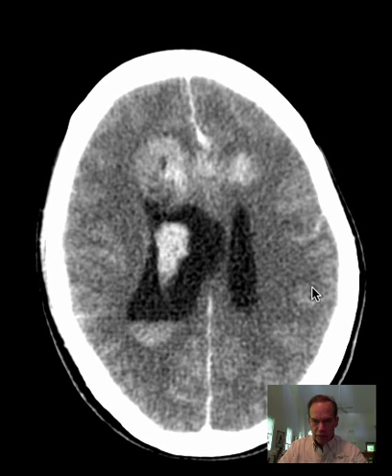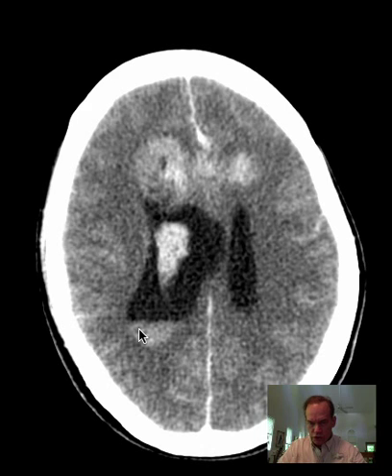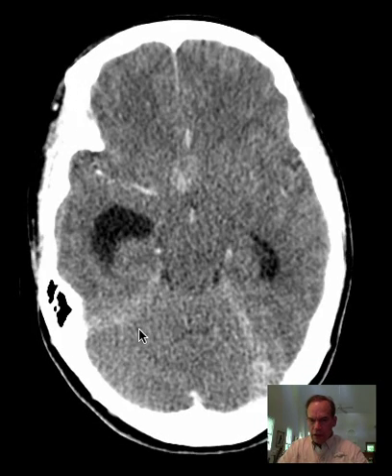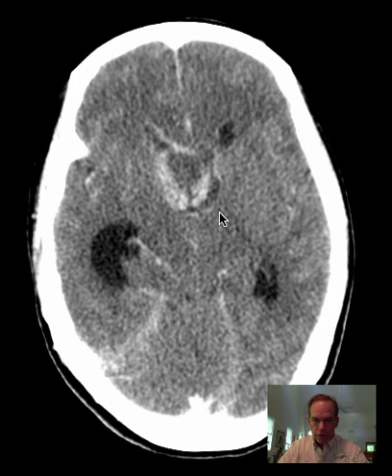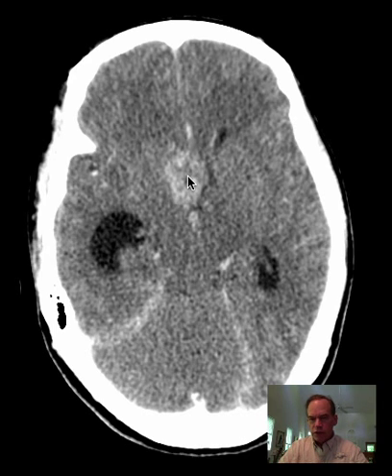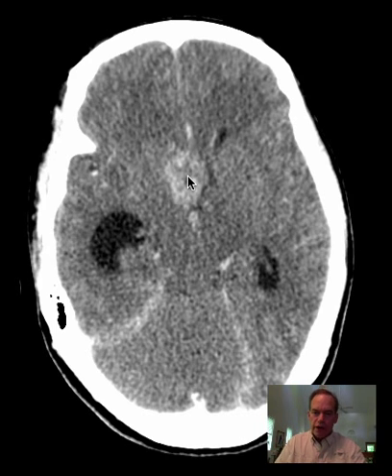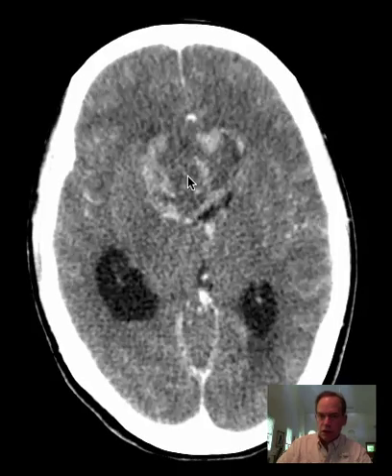If you look at the cortical sulci of the hemispheres, they're pretty much effaced — we don't see CSF in the cortical sulci — and that is an important index of how much mass effect is really going on here. When we follow the mass from its more superior aspect downward, we can see that it extends quite inferiorly. So I would say that the rostrum — the pointy, antero-inferior aspect of the corpus callosum — is involved. I would guess this involves both the rostrum and genu, but we will see that better on MRI.